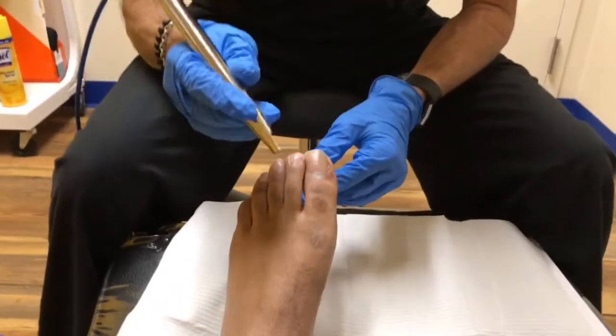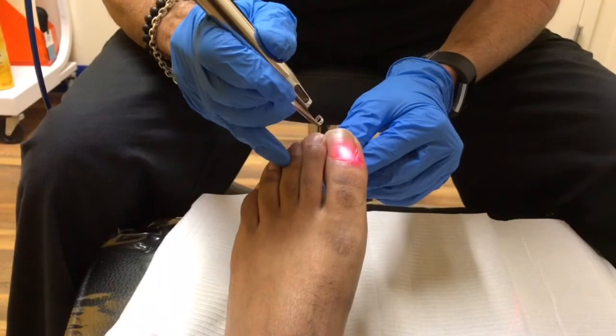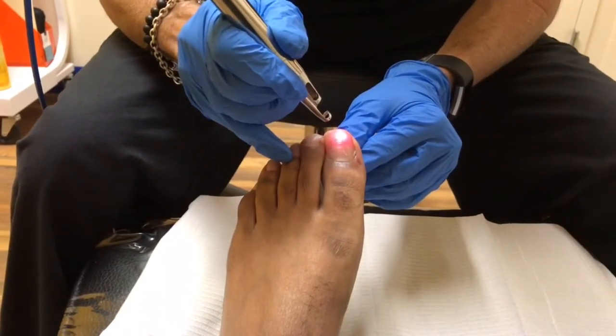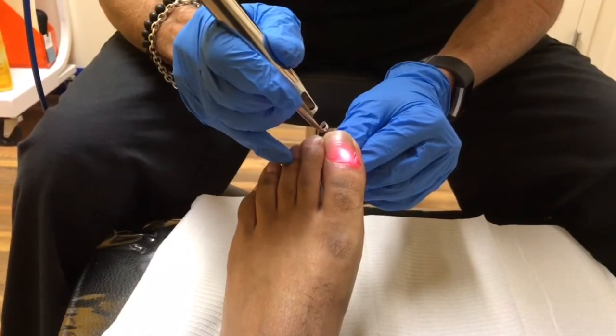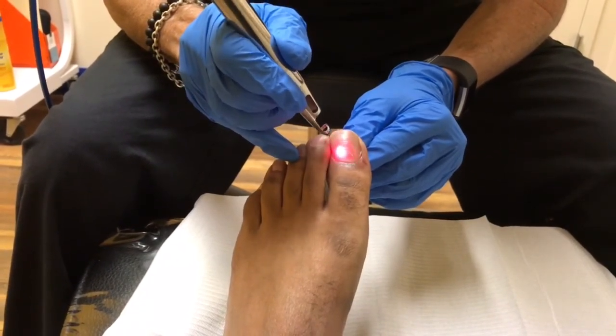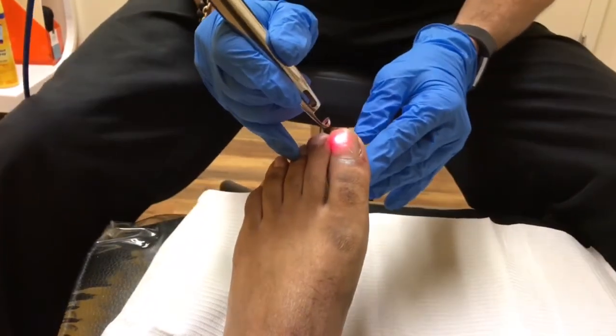The DiaWave laser produces high levels of oxygen underneath the toenail, so we paint the toenail over and over again over a 60 second period. By doing this and increasing the levels of oxygen under the nail, we're able to kill the fungus, and this gives us an excellent cure rate.